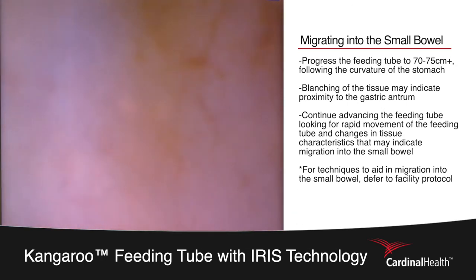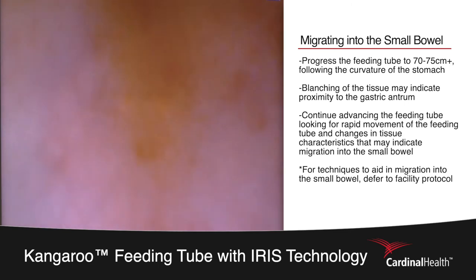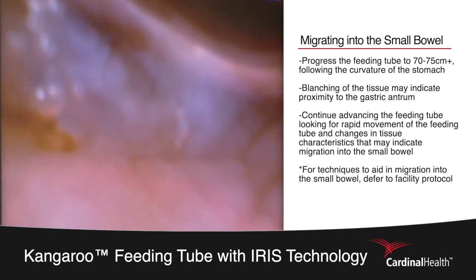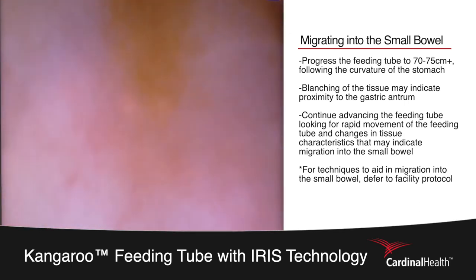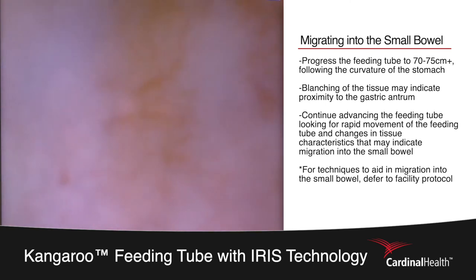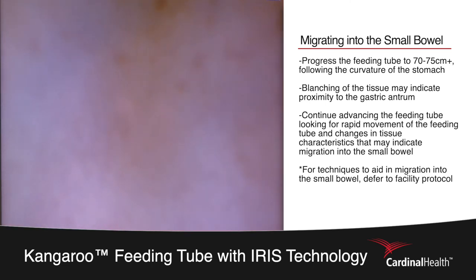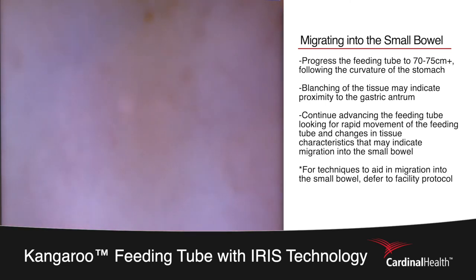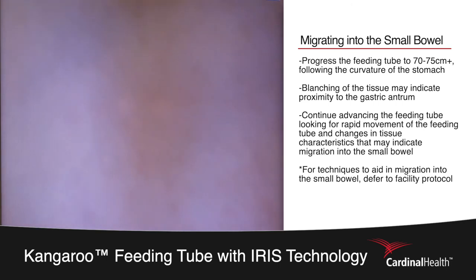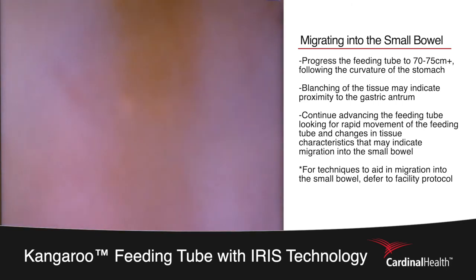At this point the placer has progressed the feeding tube to around the 70 to 75 centimeter mark, down at the antrum of the stomach. We will be looking for the tube to progress into the small bowel, which can be easily seen by rapid movement of the feeding tube, almost popping into the small bowel, as can be seen here.